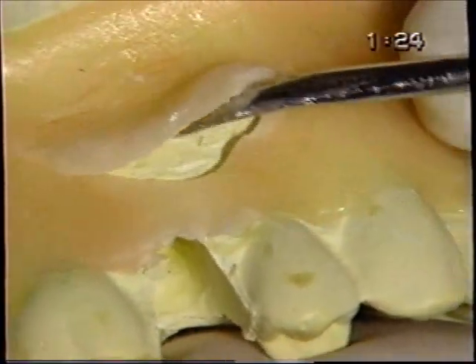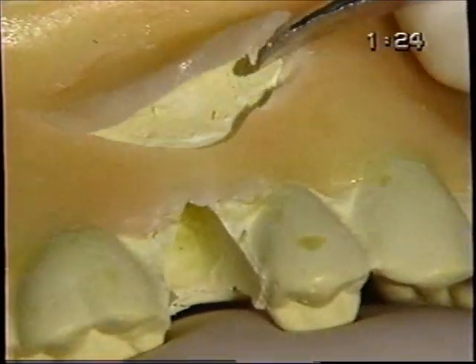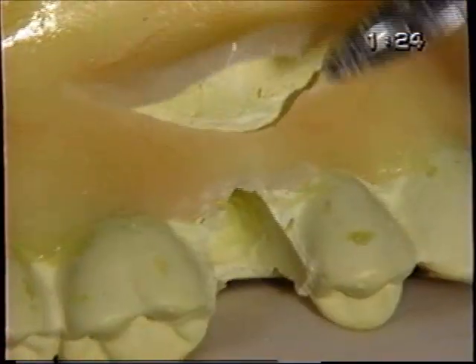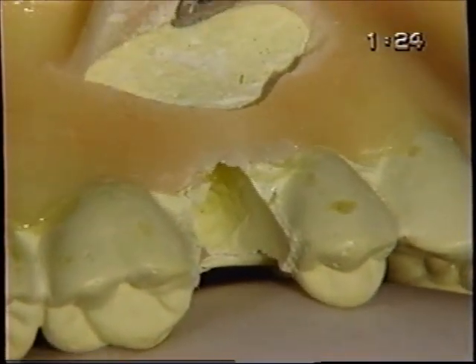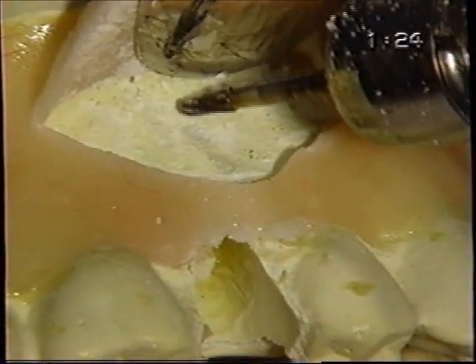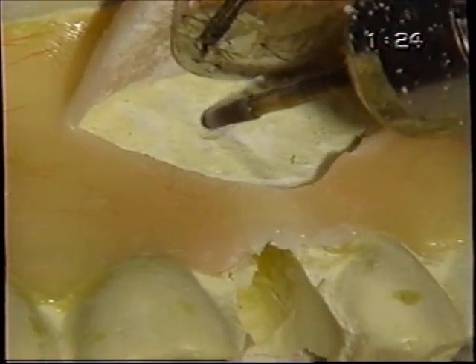There we go. How's that? Now we have to have some indication where the end of the root is. So we take the x-ray and measure how far it is from the occlusal surface to the end of the root. Then we put that measurement, that ruler, in the mouth and try to determine that. Right now I think we're just going to make a guesstimate, and it looks like we're going to be right there. I'm going to make a little window.